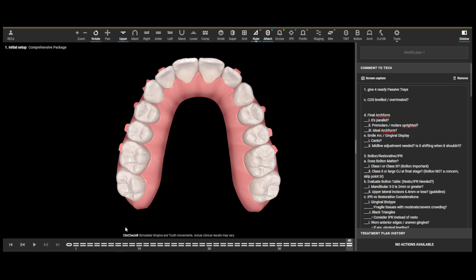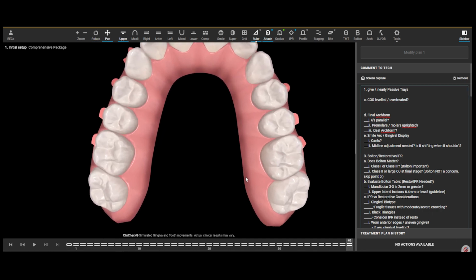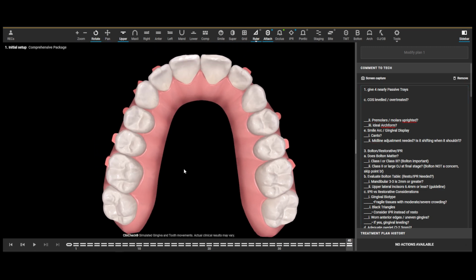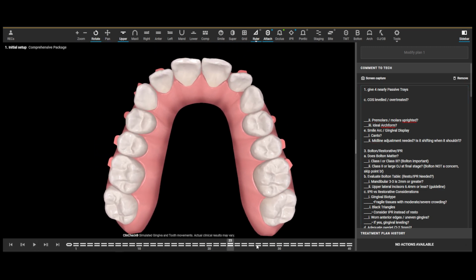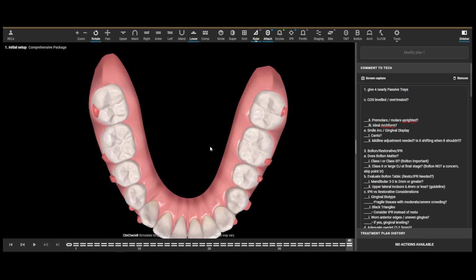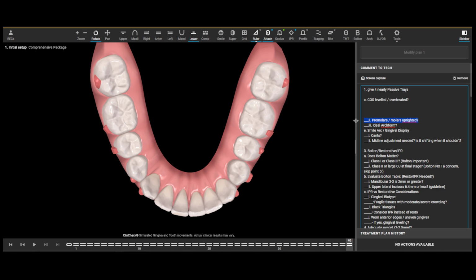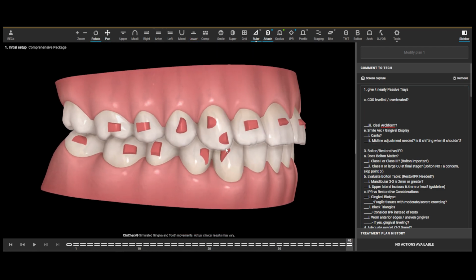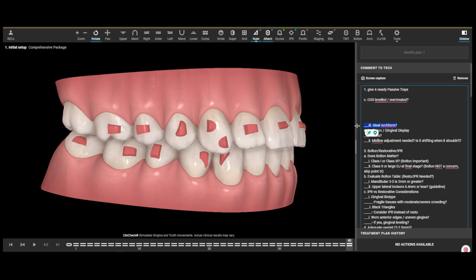So are the upper first molars derotated in parallel? They're okay. They're not great. They're not terrible. But essentially, we just want to see if they're really, really rotated and more rhomboidal, we want to derotate them more. Do we have a nice arch form? So are the premolars and the molars uprighted? Like, do we have a nice shape to our arches? And we do. Again, I'm not going to go through every single detail and aspect in these cases because I want to focus a little bit more on the TADs part for you guys. But I also want to, again, not ignore the aligner side. So we do have a good arch form.